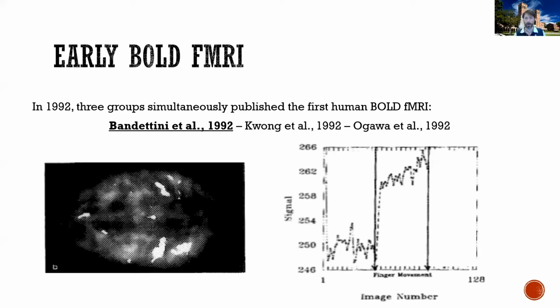Okay, so this is the logic of the MRI experiment. We find the piece of the brain where the signal changes between two conditions, rest and active, and we say, well, if the signal changes, remember that initial picture I showed you at the beginning of this lesson, you can do it backwards. You say, well, if the signal changed between two conditions, it means that the magnetic field in this part of the brain must have changed. What leads the magnetic field to change? Well, increase in oxygenation. Okay, so what leads to increase in oxygenation? Well, a change in cerebral blood flow and cerebral blood volume.